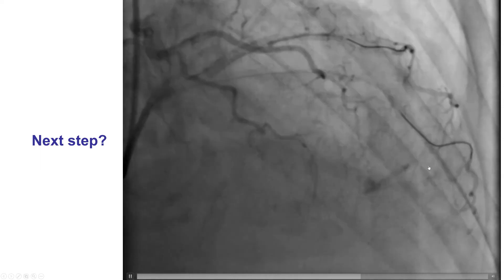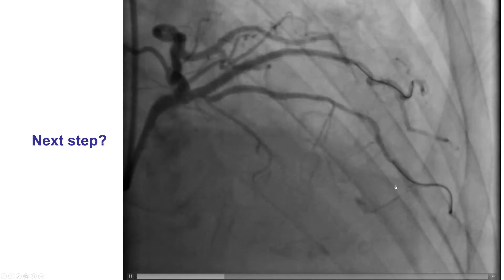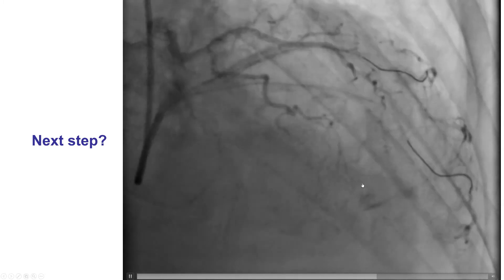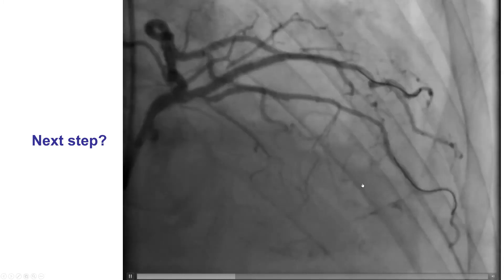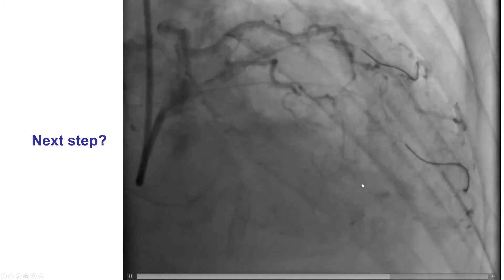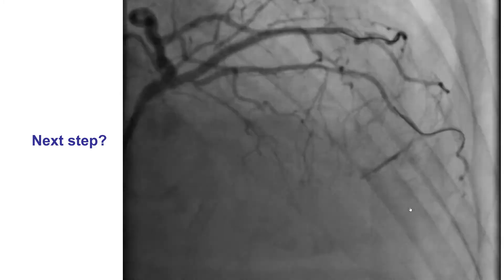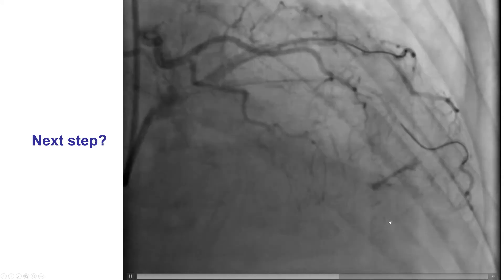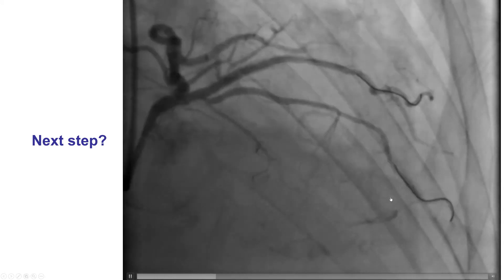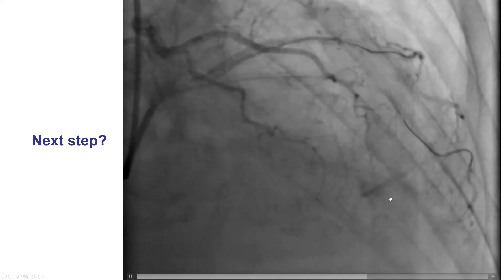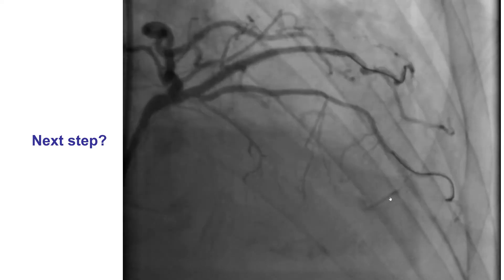Now we had this communication between the septal branch and a space, which created concern — did we perforate into the pericardium? There was rapid clearing of the contrast, which is a good sign, meaning we are most likely communicating with a cavity — the left or right ventricle in this particular case.